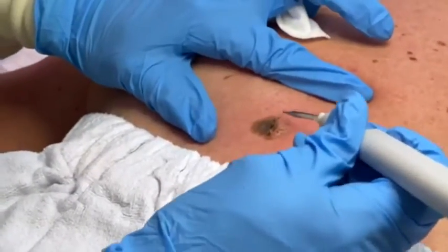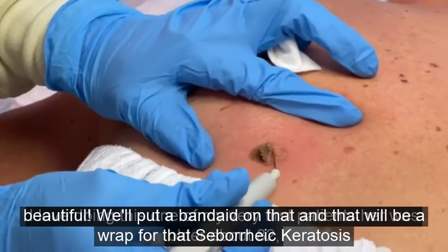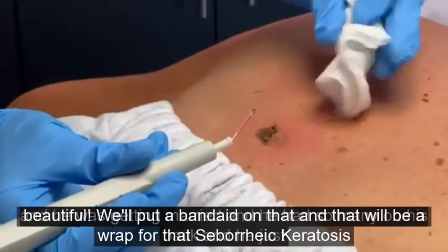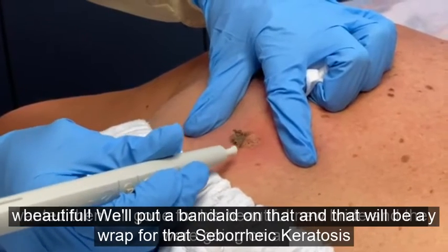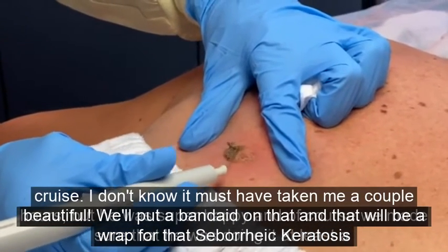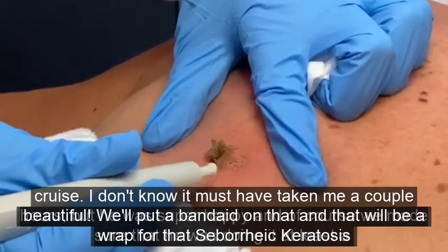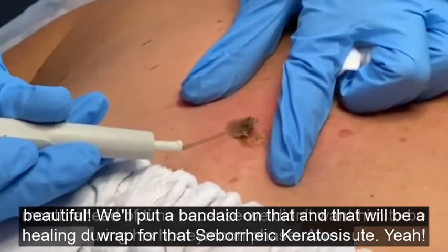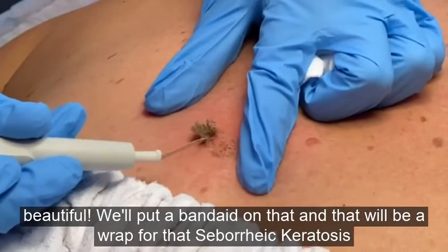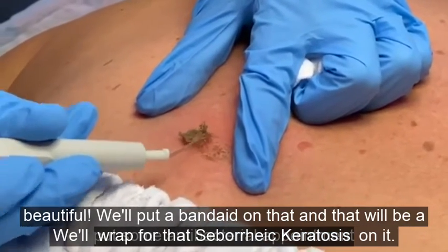It's very precise, and you can see how easily this comes off. One of my very first patients was about 82 years old and he was getting married. He had so many lesions on his back and just wanted them all gone for his new bride — they were going on a cruise. It took me a couple of hours, but he was super happy when we were done. We made sure to do it at least a month ahead of time so he wouldn't be healing during the honeymoon. Super simple — and then we'll put some antibacterial ointment on it.